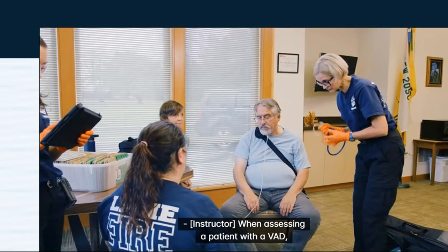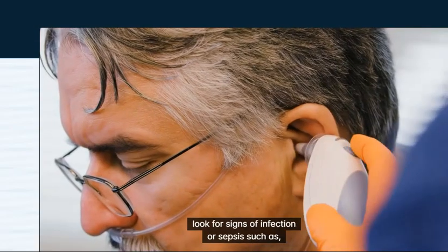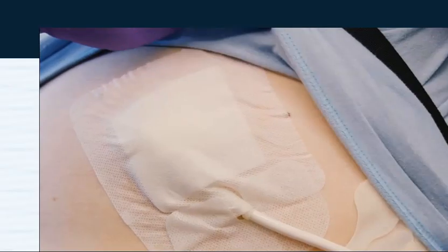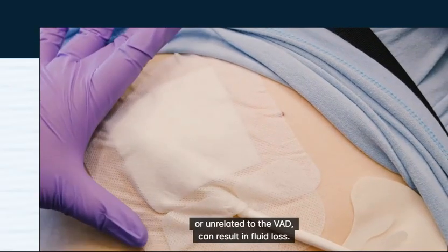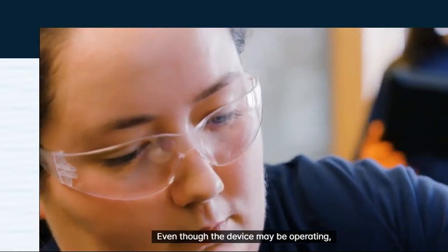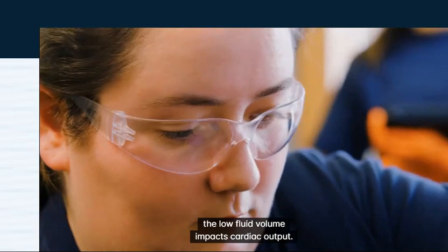When assessing a patient with a VAD, especially one who has recently had the surgery, look for signs of infection or sepsis, such as fever or tachycardia. An infection at the site of a VAD lead or unrelated to the VAD can result in fluid loss. This can negatively affect a patient. Even though the device may be operating, the low fluid volume impacts cardiac output.